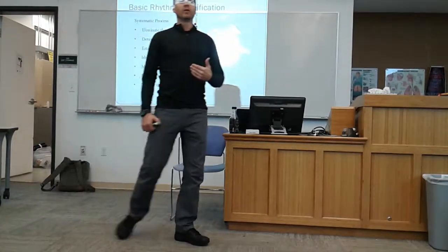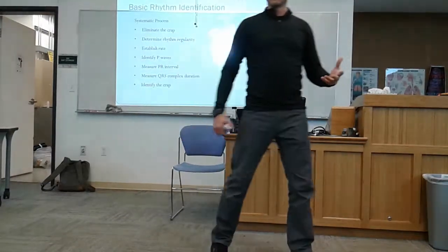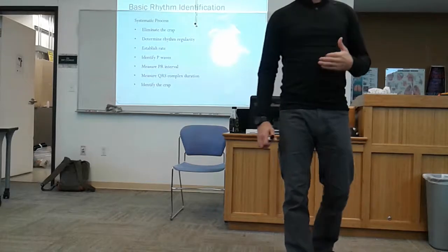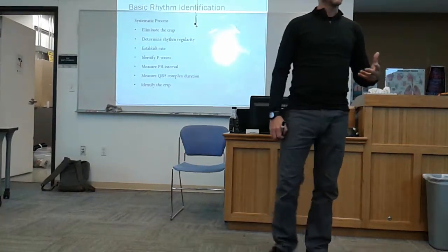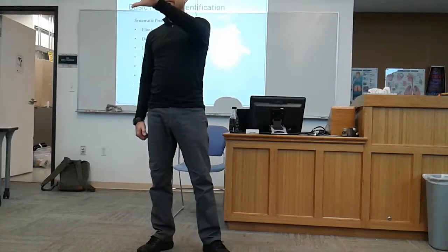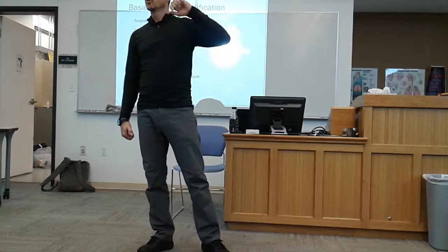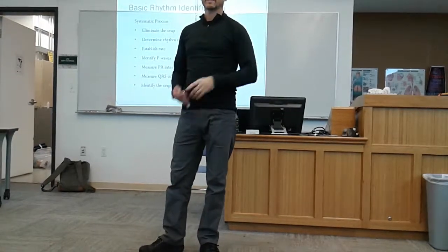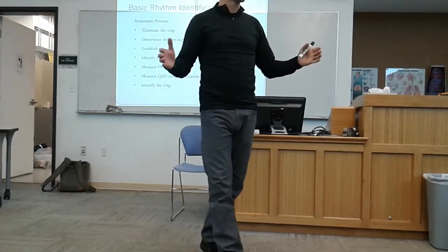And the way that you say a rhythm, or the way that you write a rhythm, or the way you discuss a rhythm with somebody would be to say what the analysis is, then plug in the word "with," and then list the crap. That's how you discuss it.